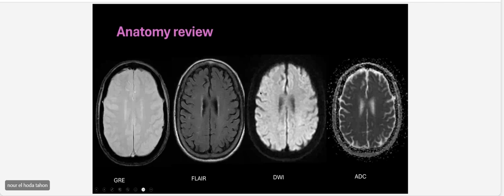If I talk about cytotoxic, let me imagine this like a stroke. In cytotoxic edema, you cannot differentiate the gray-white matter junction.